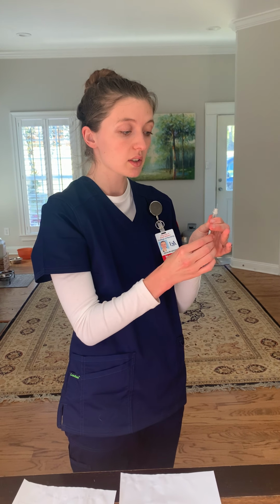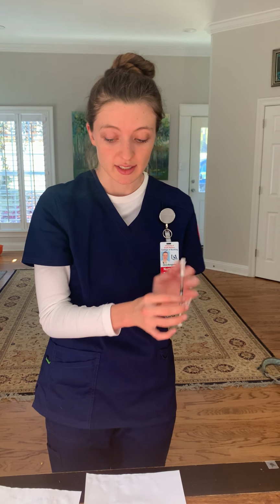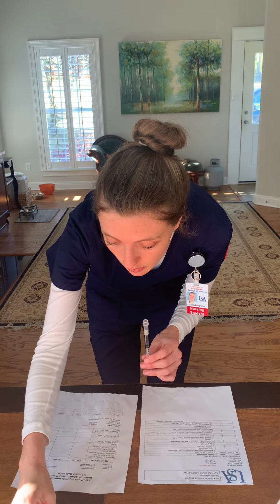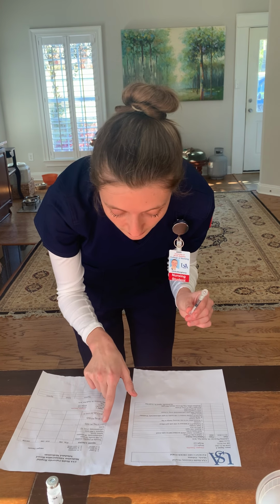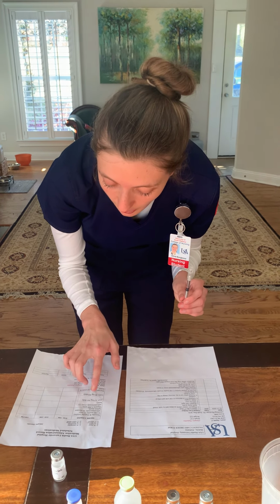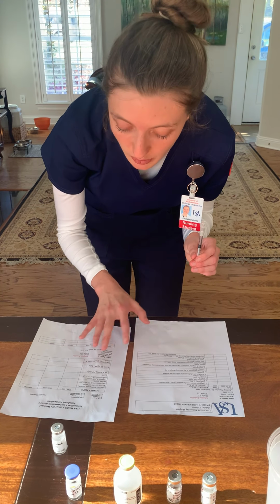I'm now going to verify with another nurse that this is the right dosage and the right calculations. Once she verifies that, I will then again refer to my medication administration record to confirm that everything is right. I will use my vial and my syringe, make sure that the heparin, so right medication, 5,000 units, right dose, subcutaneously the right route, and every 12 hours, which is the right time.